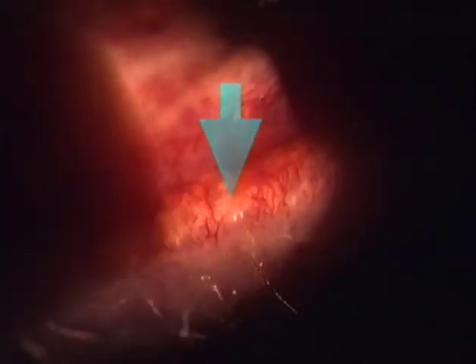If we examine the surface reflexes at the orifices, we recognize protuberances, which indicate that the secretions are densified and solidified. This assumption is substantiated here by the presence of extruded, elongated solid material. All these surface irregularities may cause irritation. But the main culprit for symptoms is the solidified extrusion from this gland here, because this has caused a chronic surface abrasion of the cornea.